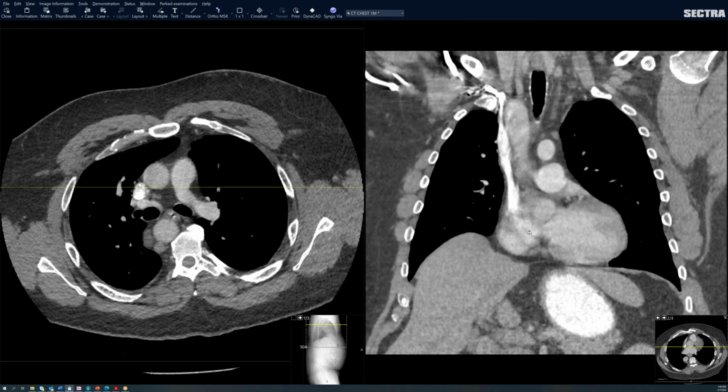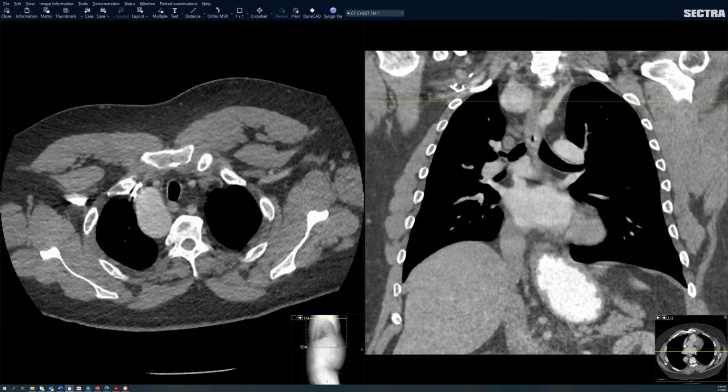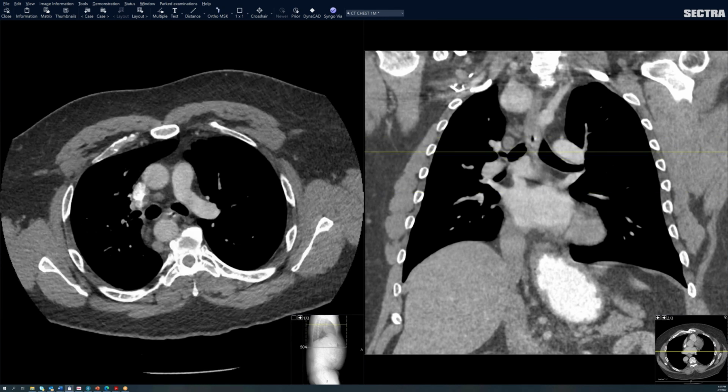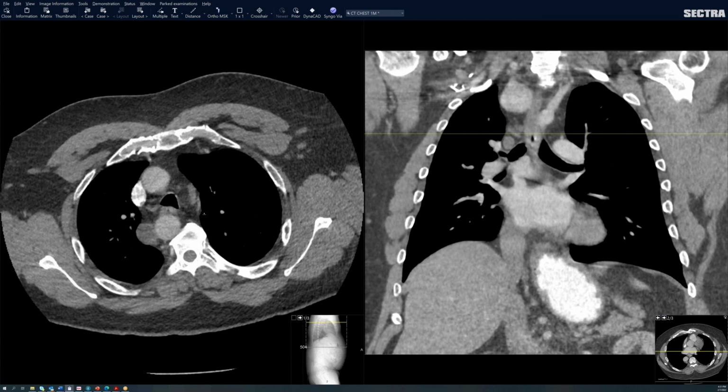So crisscross PAs can have a fairly significant association with other congenital heart diseases. By themselves, they don't really cause too much. But we've seen a little kid who had crisscross PAs and bronchomalacia, so they did a 3D splint based off the CT data set, and they used that splint for treating the bronchomalacia.